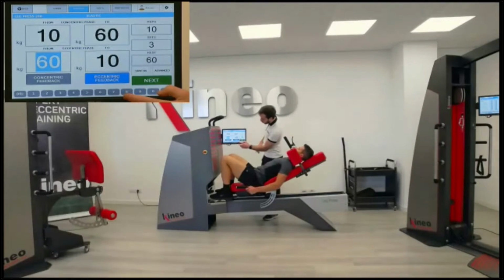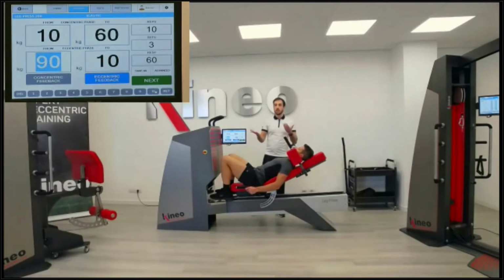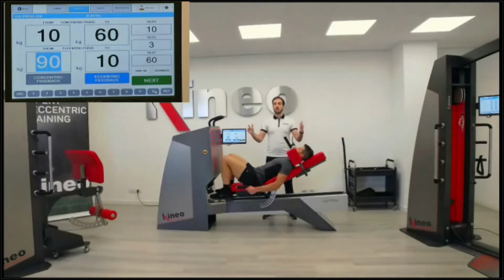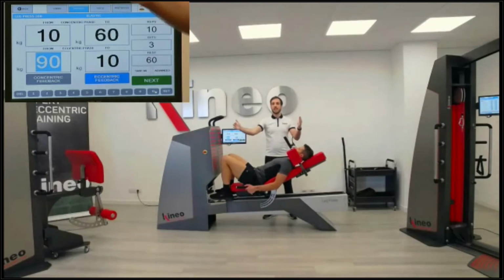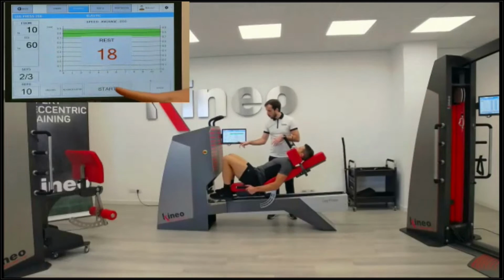And here you will recollect the fact that we can do differentiated loading also with elastic. So this is a proper way to have eccentric loading with elastic. He will have 10 to 60 kilograms in concentric, but he will have 90 kilograms from here, and he will go back in eccentric with more load at the end of the range of motion. So let's try it.